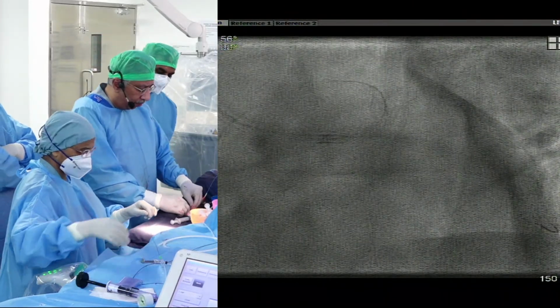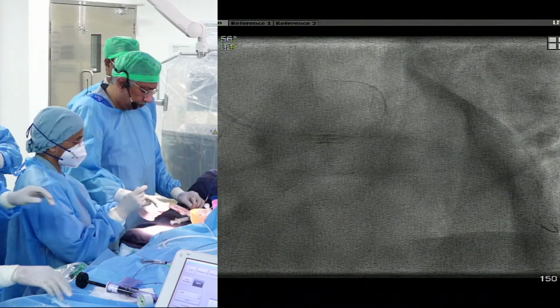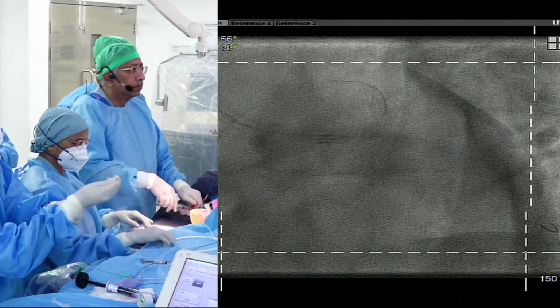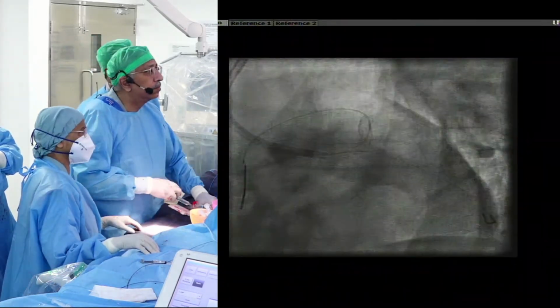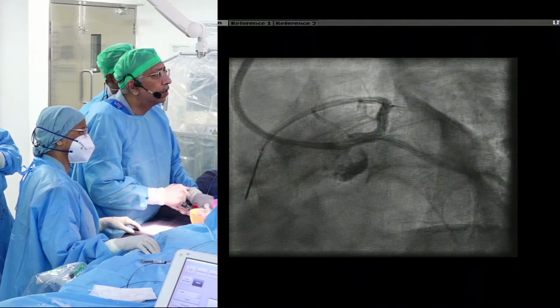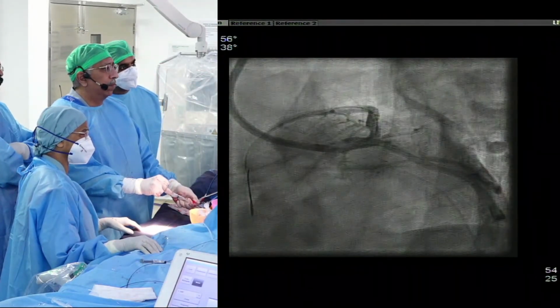We just published Heart Lung Circulation data of 2,400 STEMIs, of which 24% were young myocardial infarction, 33% are smokers. A lot of them had large thrombus. That's very good. Excellent. Nightmare to the interventionalists. Let's get a PA caudal view.